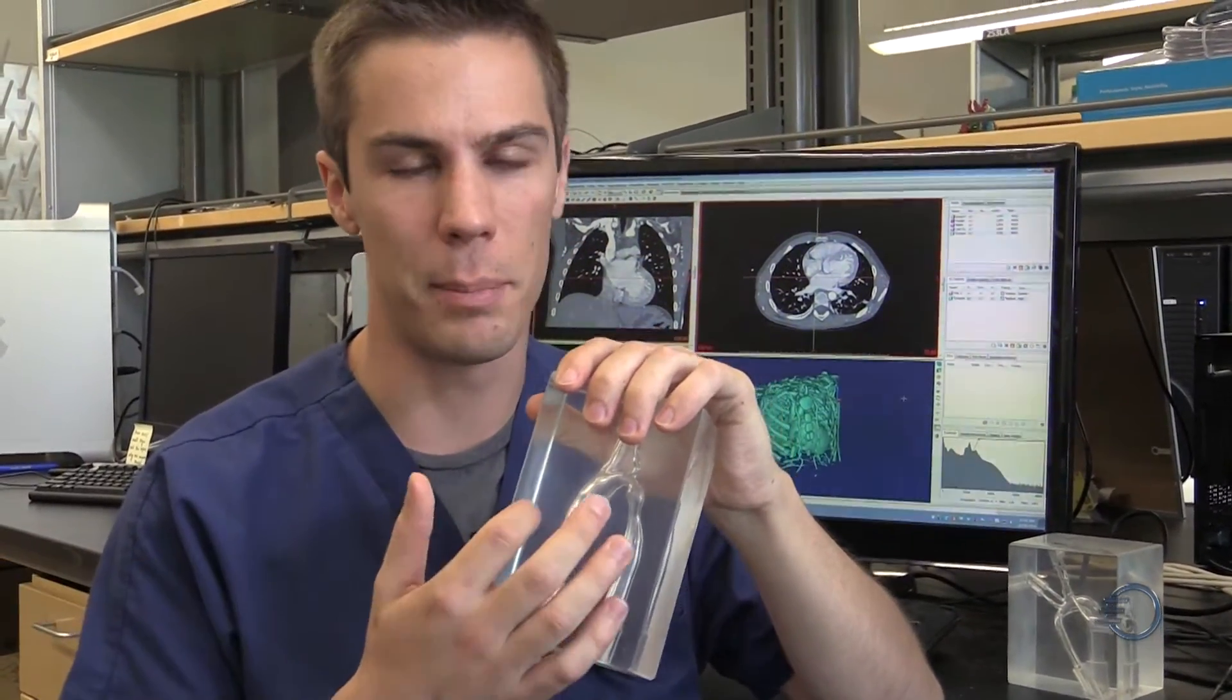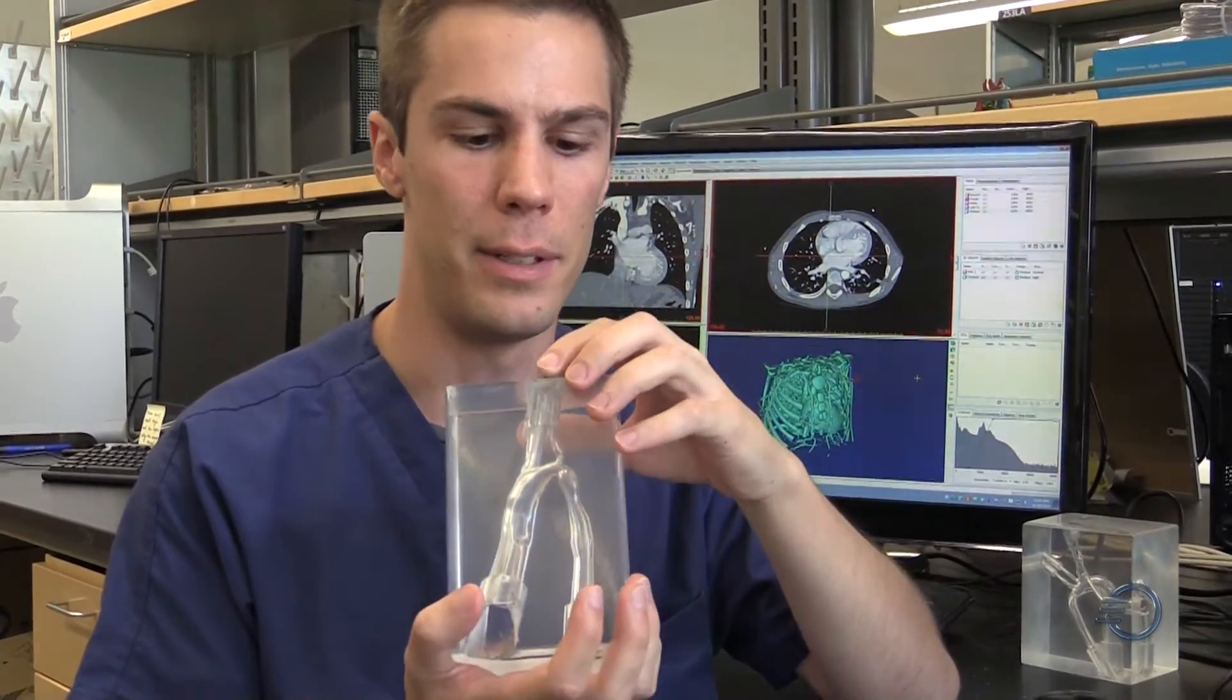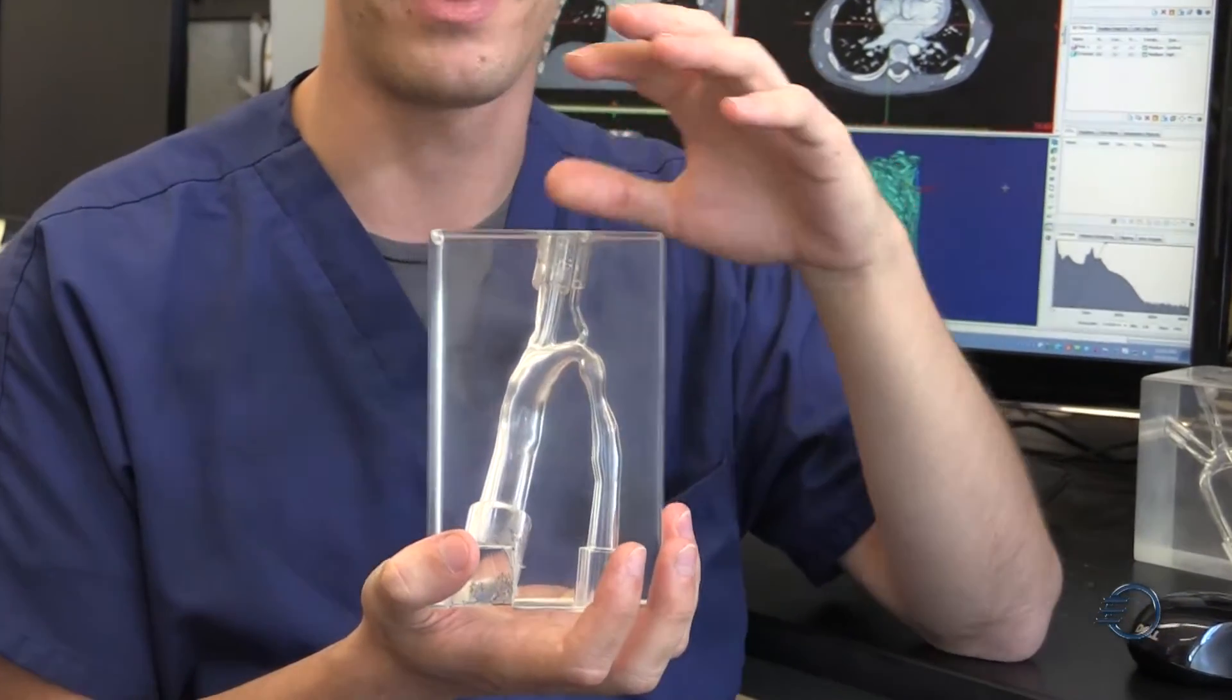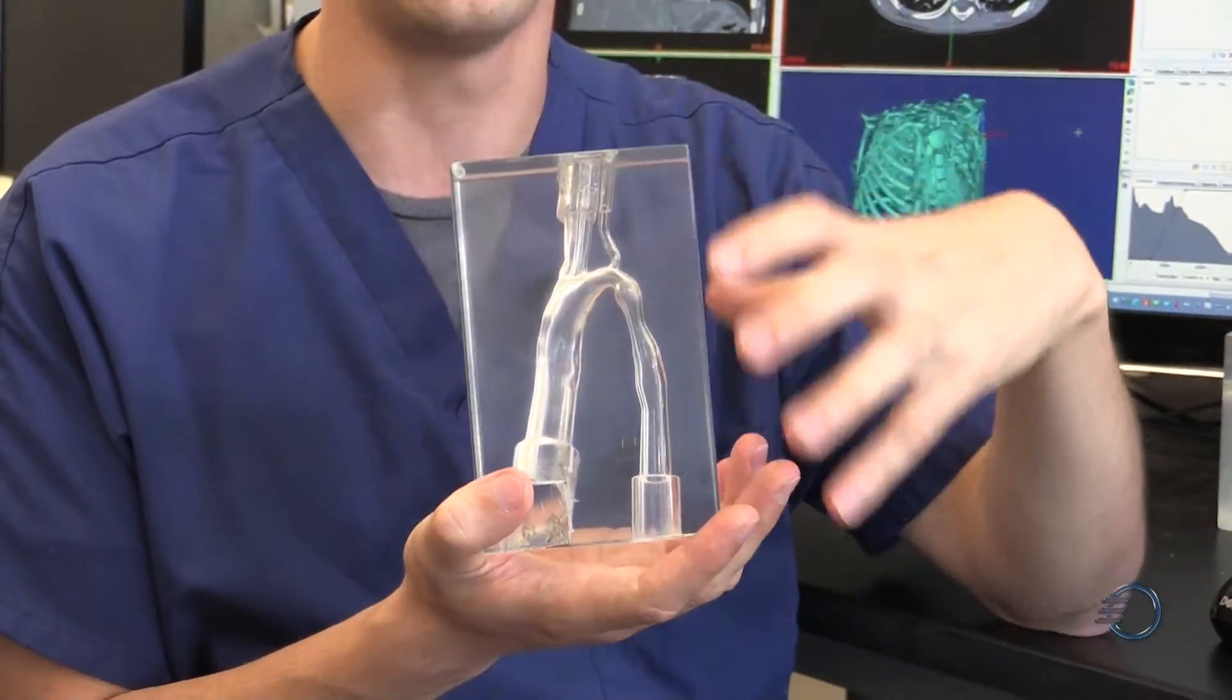This is an aorta. So what we have here is the biggest blood vessel leading off the body. We want to understand how malformations or diseases such as stenosis, which is narrowing in an aorta, can lead to high pressure or low pressures in different areas of this anatomy.